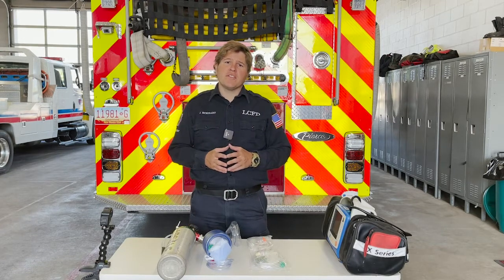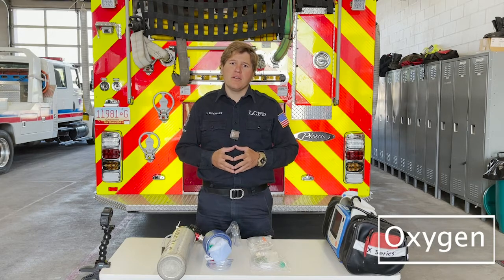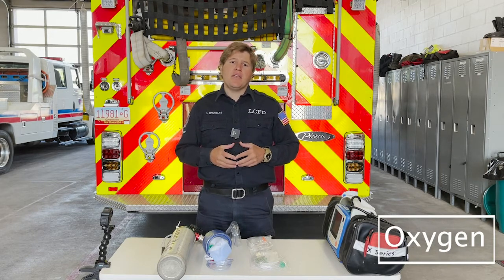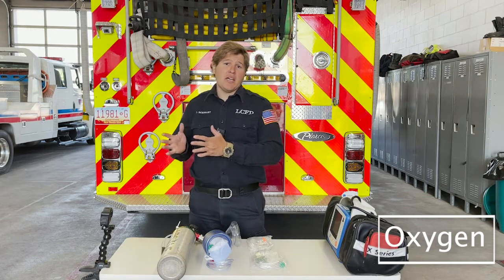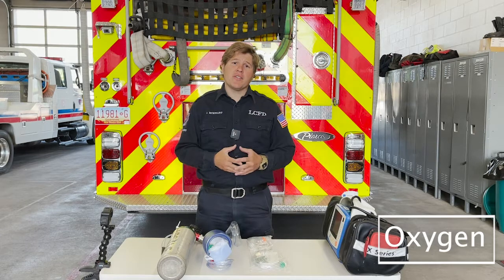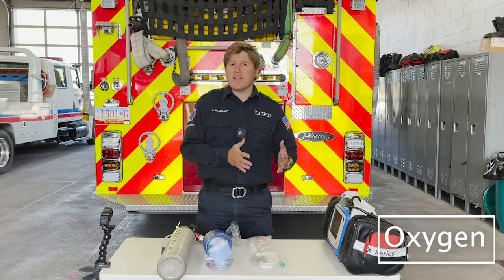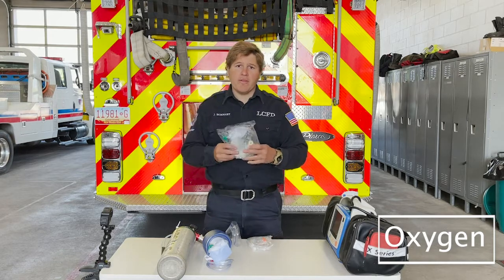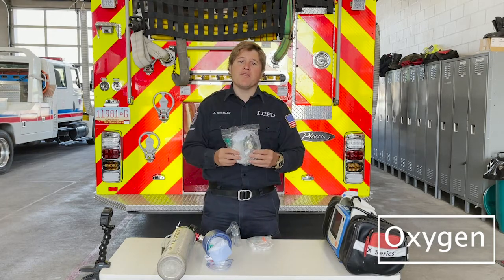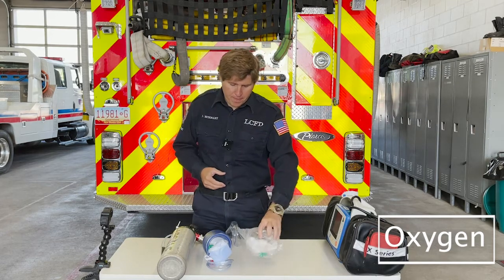All right, moving on to the second letter of the acronym SODA, it'd be O, again for oxygen. Just think anything that we need to provide ventilations to the patient. So initially, the type of oxygen that we apply to the patient is different. I'm here in District 6 where I have a squad usually behind me, so I don't necessarily need to utilize a non-rebreather. However, get a non-rebreather out if you need. You can put that on the patient if you're shorthanded and provide them oxygen. Have that ready to go.